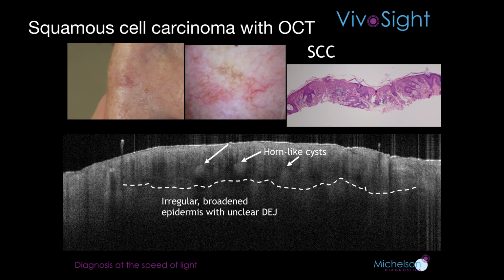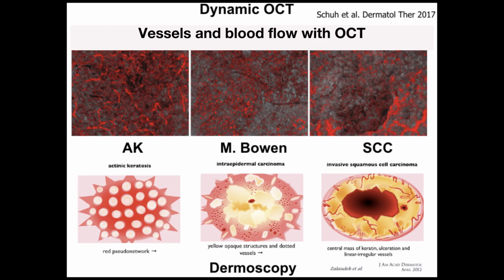The melanocytic lesions are too complex, even with cellular resolution, to do much with the machine. I guess what is great also about the machine is all the measurements, the possibility to see the blood flow, to measure the depth of the lesion. So in terms of cosmetic, or when you want to do some laser treatment, it seems to be a very good machine also, but because I'm a skin cancer person, I'm using it mostly for BCC.